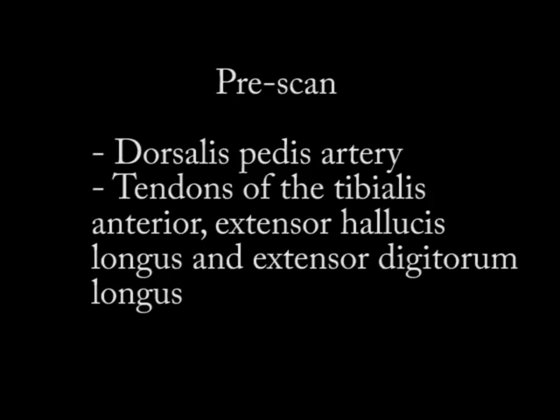On the pre-scan, we really want to identify the dorsalis pedis artery, because we need to avoid this with our injection. We also have the tendons of the tibialis anterior, extensor hallucis longus, and extensor digitorum longus. These tendons are very thick, particularly the tibialis anterior, so we want to avoid them to minimize pain and damage from the injection.